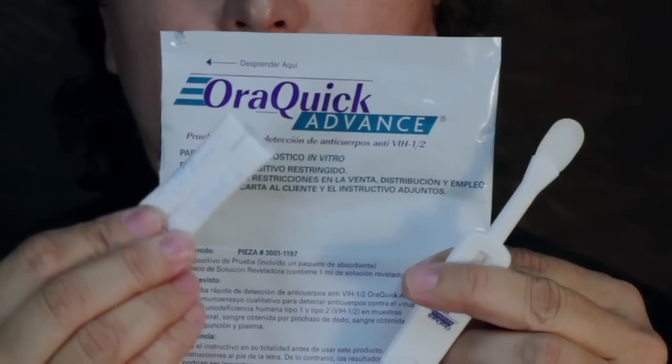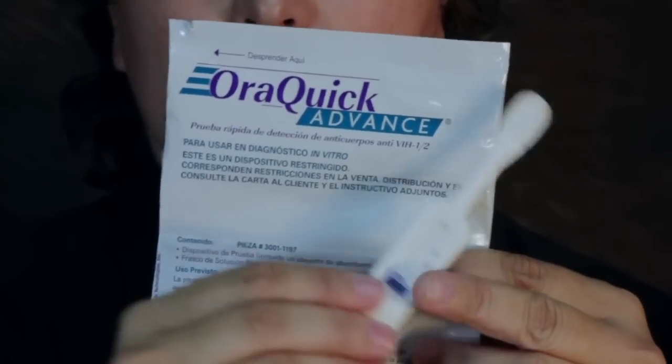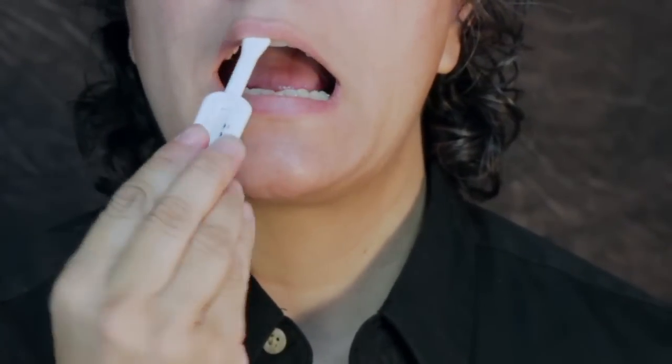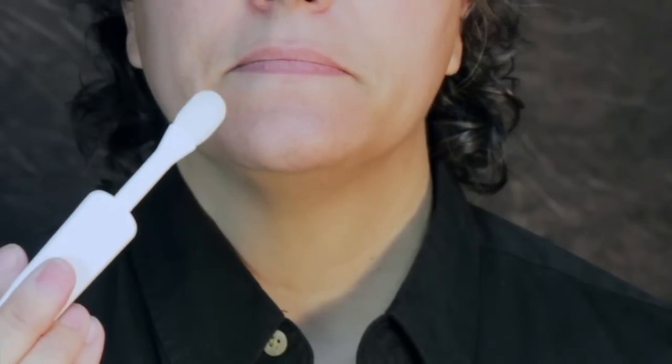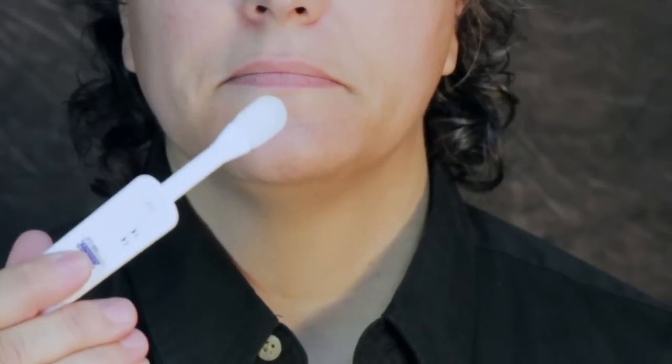The packet is not used in the testing process and should be discarded. Direct the person to place the flat pad above the teeth against the outer gum and gently swab completely around the outer gums, both upper and lower, one at a time, using the flat pad. Do not allow the person to swab the roof of the mouth, the inside of the cheek, or the tongue. Both sides of the flat pad may be used during this procedure.